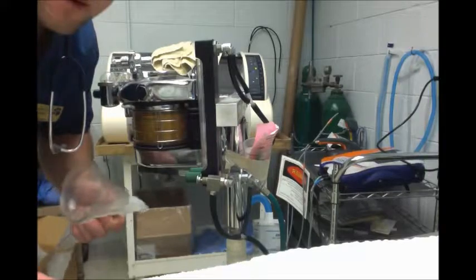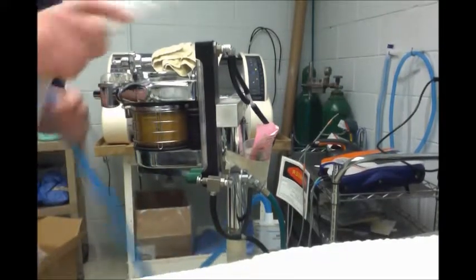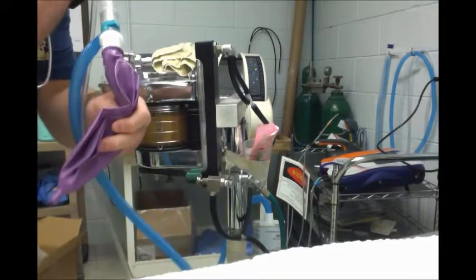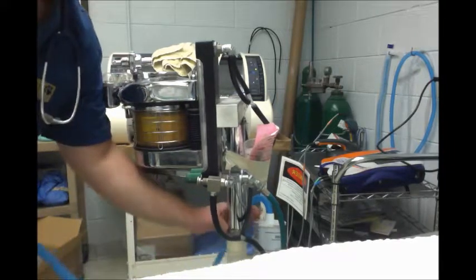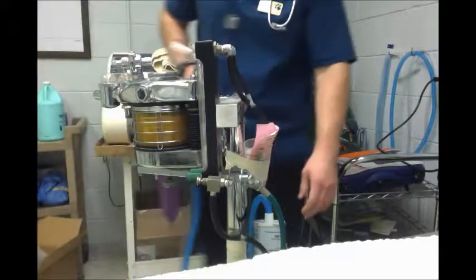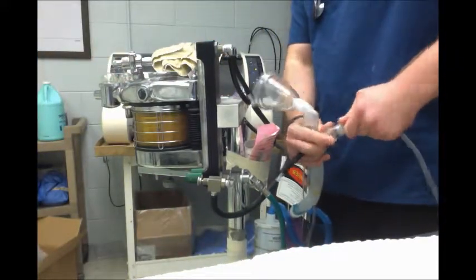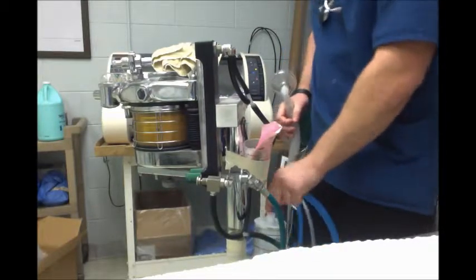Alright, so we're just going to go over the anesthesia machine real quick here. Right now we've got the non-rebreathing system hooked up, so we've got our bag here. The scavenging system hooks up to the back here, and then we've got the oxygen, which hooks up right here. So we'll take that off, and then we'll hook up the rebreathing system.